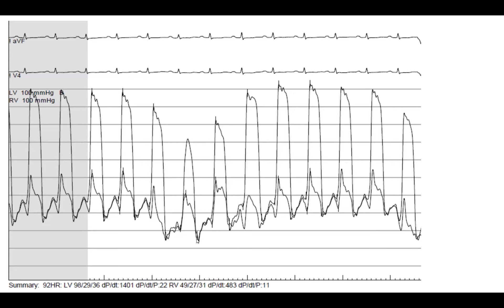This is inspiration, this is expiration. Then you compare on those two beats the area under the curve — the pulse volume. On the inspiratory beat, this is the right ventricle; this is the left ventricle. On the expiratory beat, the right ventricle is actually shrinking, even though the systolic pressure seems to be rising, but the pulse volume is actually shrinking while the LV pulse volume is actually expanding.